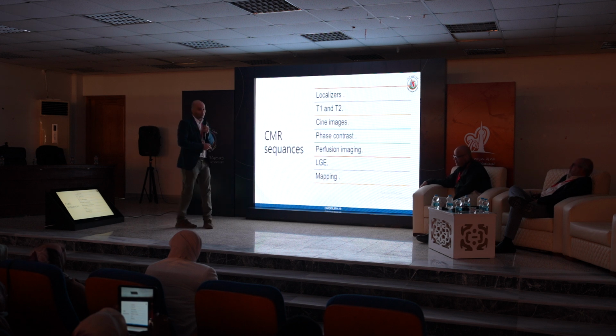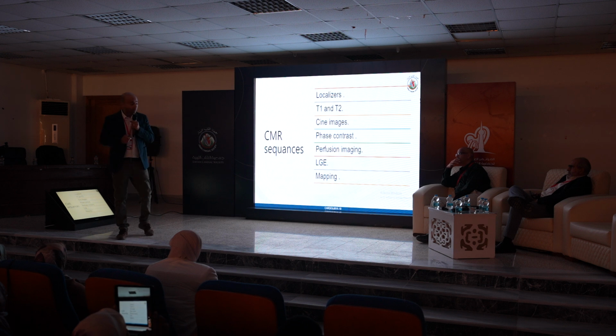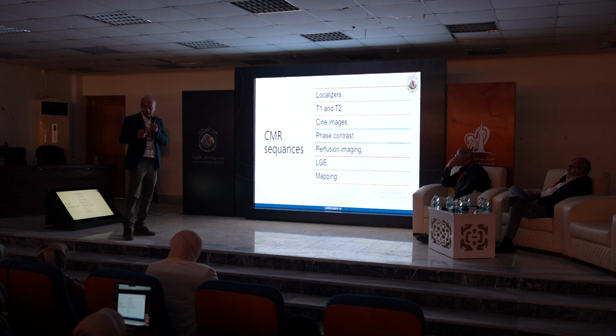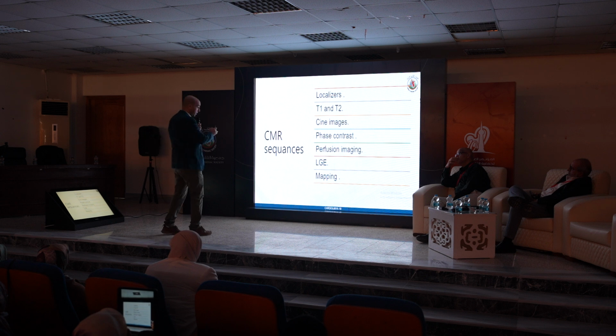Perfusion imaging, we usually use it with masses to assess their vascularity, and in stress imaging, on perfusion stress imaging.